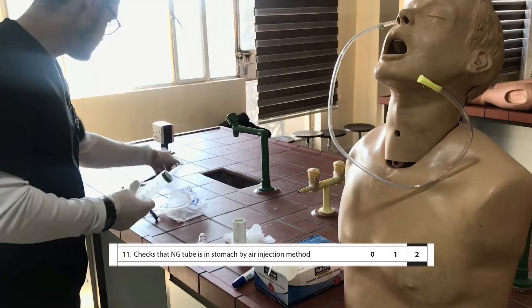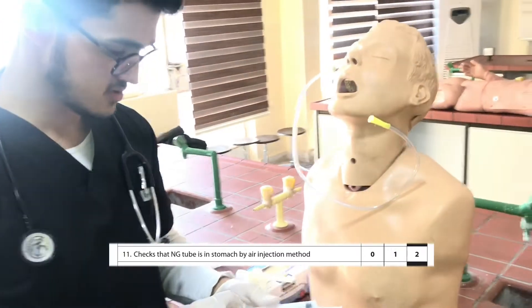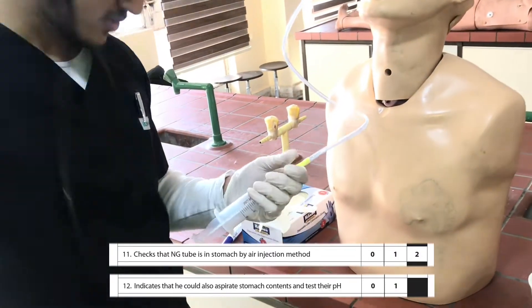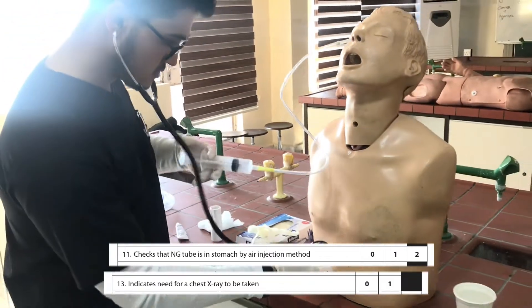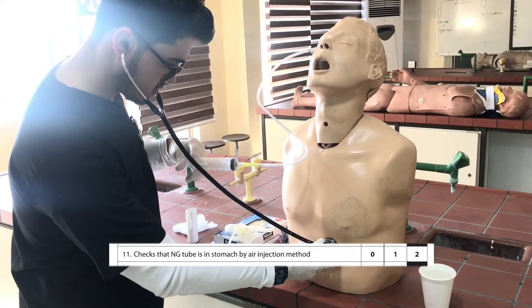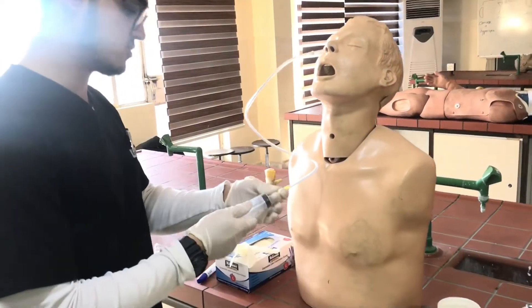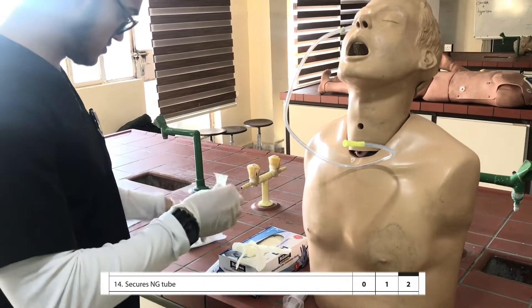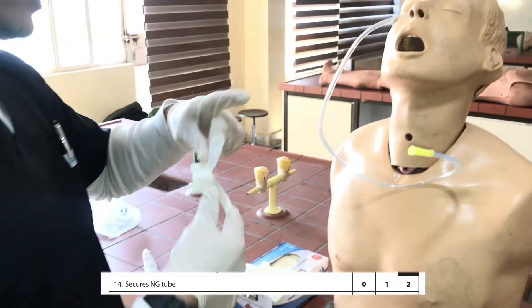Then I check that the tube is in the stomach using the air injection method. Now the tube is confirmed in the stomach and I start securing the tube.